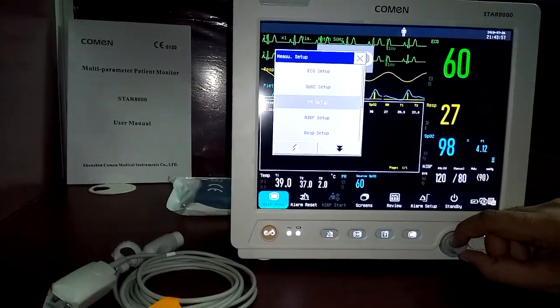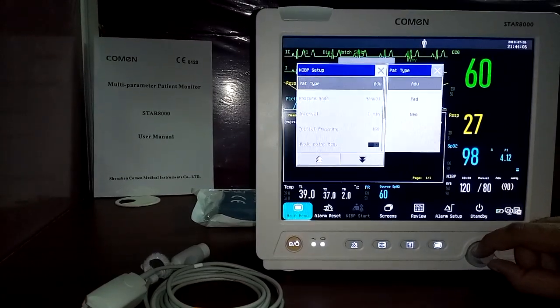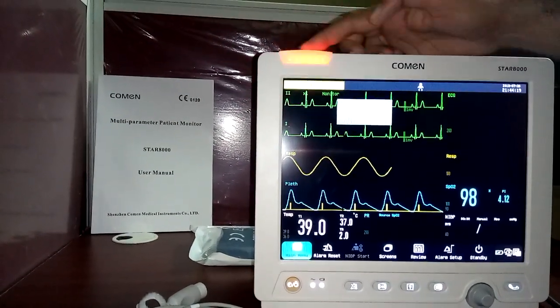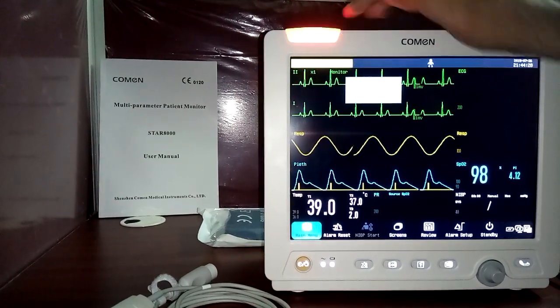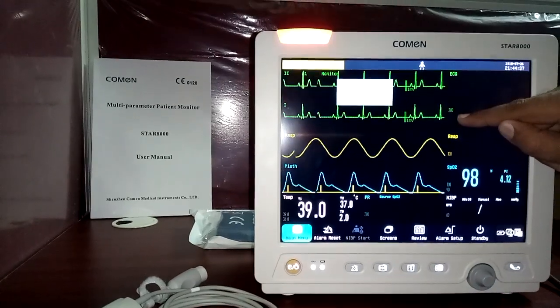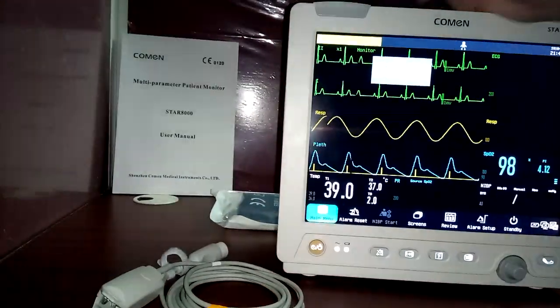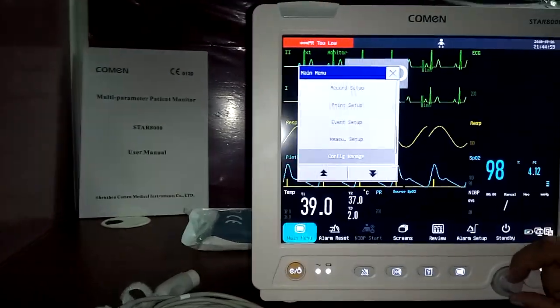Under measurement setup, you can configure SpO2 pulse rate settings and NIBP settings. For NIBP, you can select patient type — adult, pediatric, or neonatal. When neonatal is selected, all alarm limits change automatically. For example, the neonatal pulse rate limits are 100 (lower) to 200 (upper), so a reading of 60 triggers a high-priority red alarm.